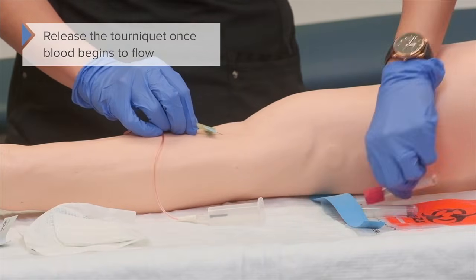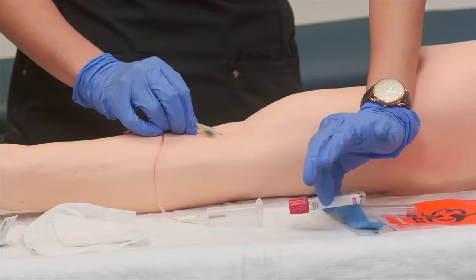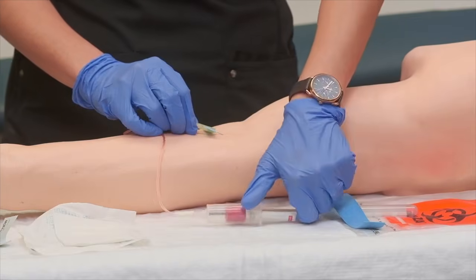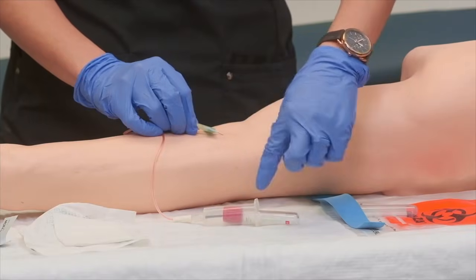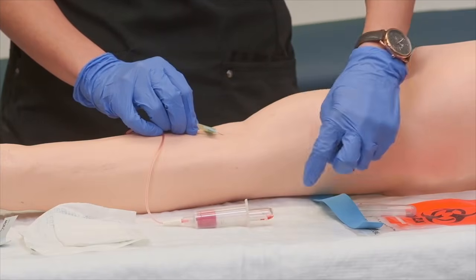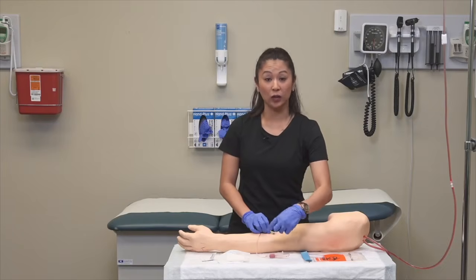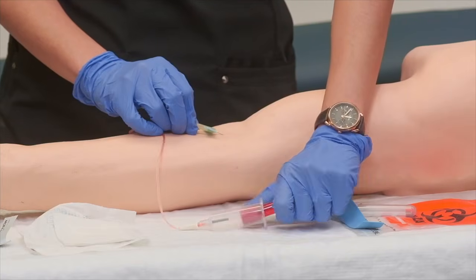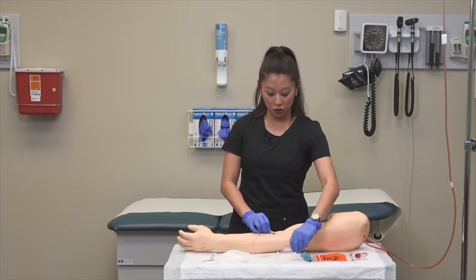Now we can go ahead and take our waste tube, and I like to just keep it here flat. Take my waste tube, stick it into the blood transfer device and push the end. Now what's really neat here is this gray that you see has a puncture that will release the vacuum to help pull the sample. So I'm just going to push this all the way to the top and it's going to fill. Now once we decide that there's not any more air in the line, we can remove this by simply pulling this off, get rid of our waste tube, and then replacing it with our lab collection tubes.